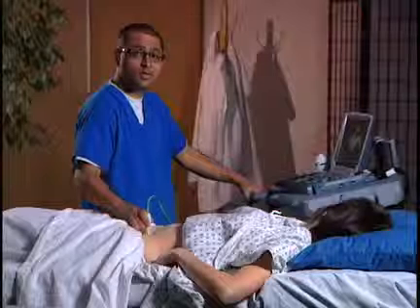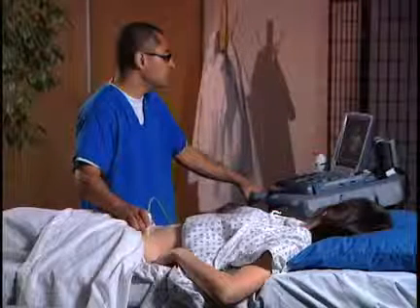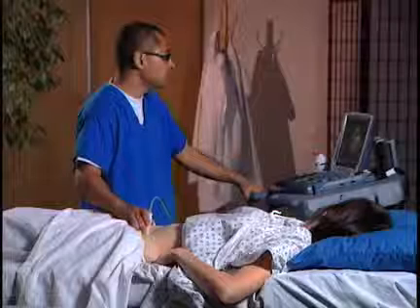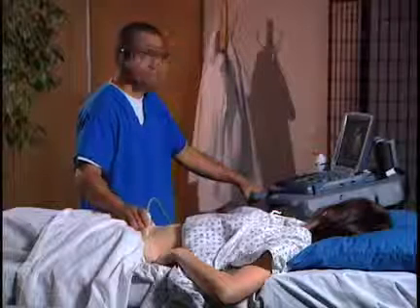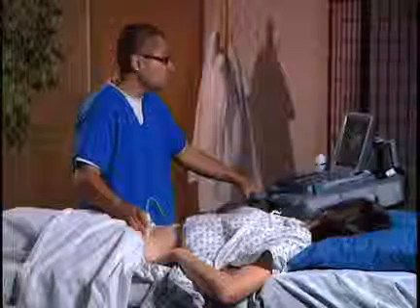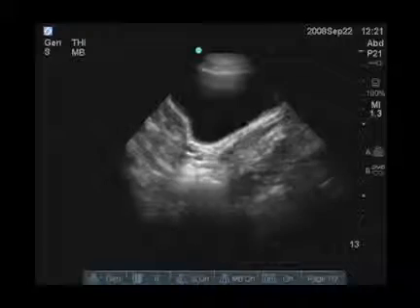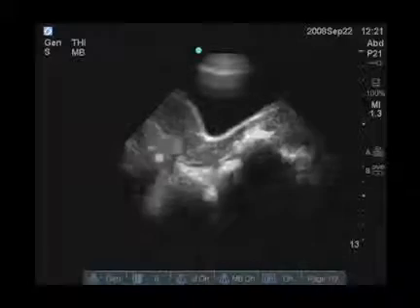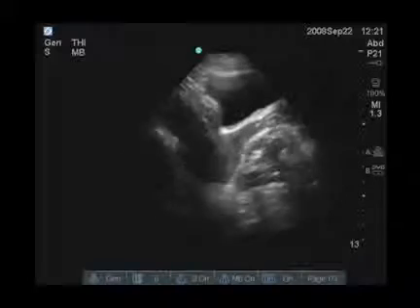When we scan this patient in a sagittal view, we go from the patient's left to the patient's right, slowly scanning to see if there's any evidence of free fluid.